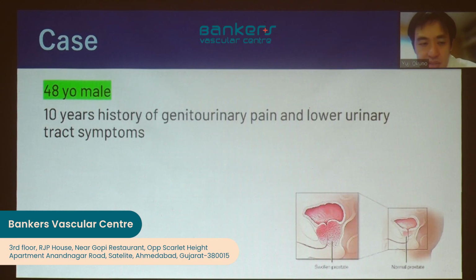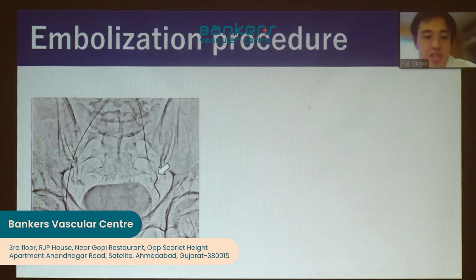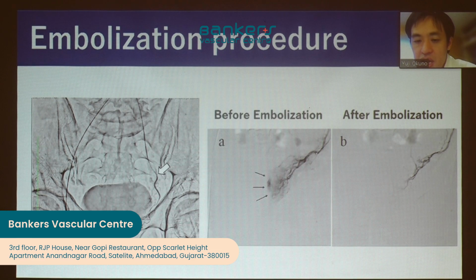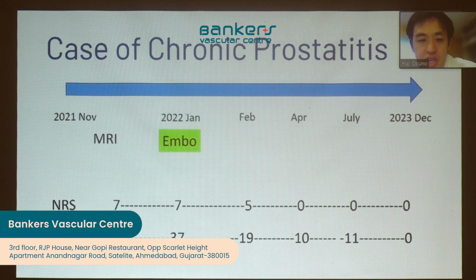So going back to these patients, they had already received many medications but did not improve. So we planned to do the embolization treatment from a groin puncture, with bilateral prostate artery angiography and embolization. And for this case, we reported good results.